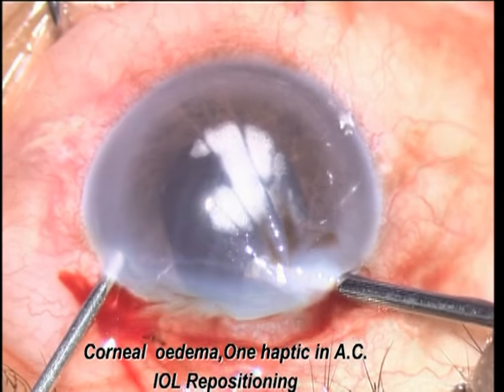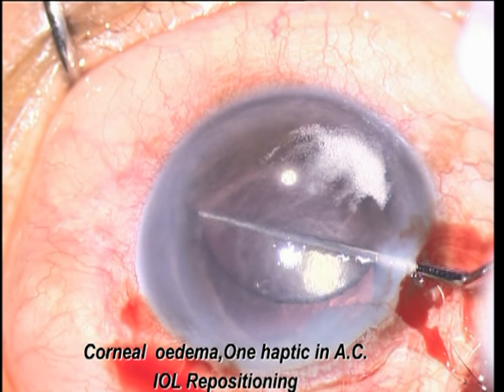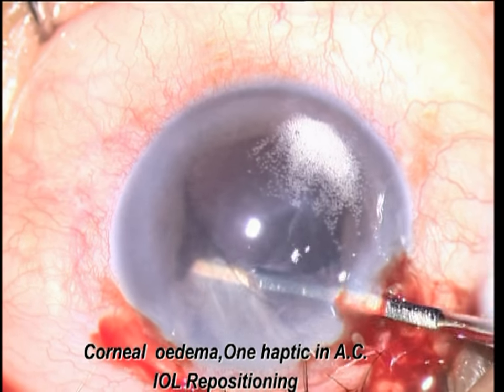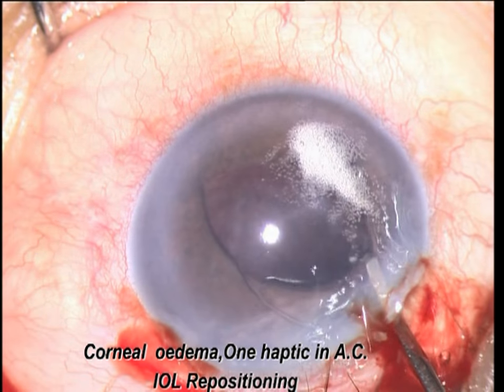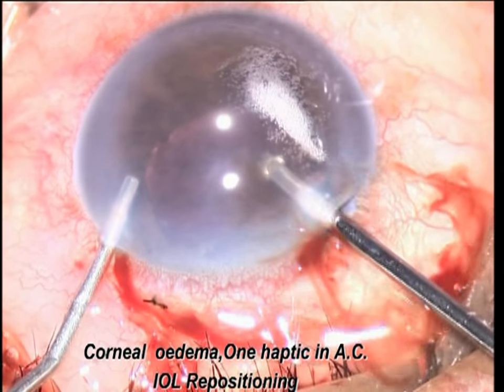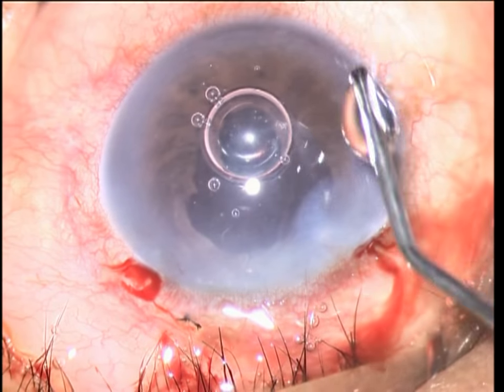This is another case presenting with corneal edema. You can see persistent corneal edema because of the haptic touching the cornea from the upper part. With the help of triamcinolone, identify the vitreous and do anterior vitrectomy. Separate the iris and all fibrous bands. Rotate the lens into the sulcus after assessing the remnant anterior capsule extent. Do anterior vitrectomy again, and you notice the clarity of the cornea on the table.